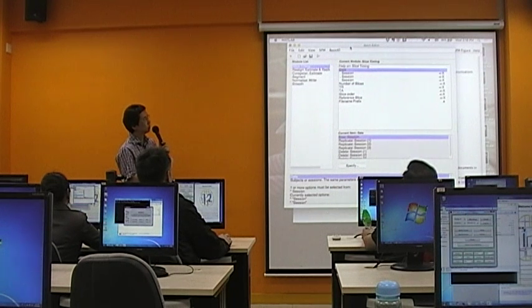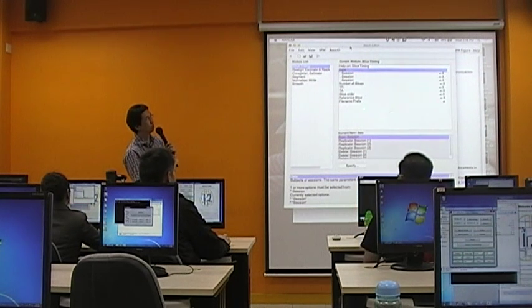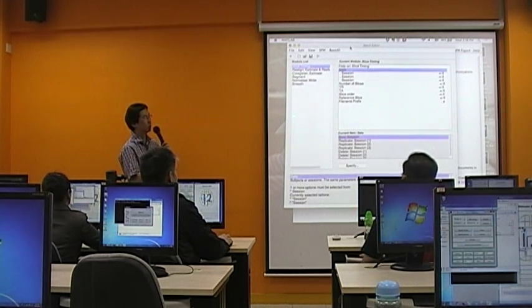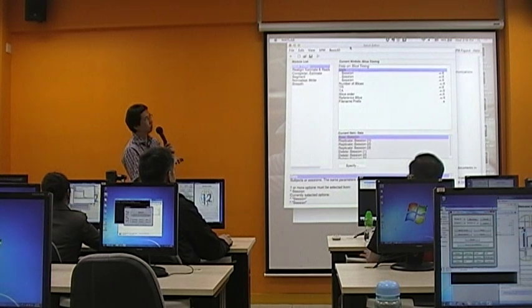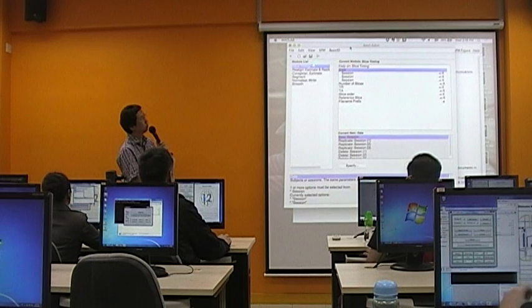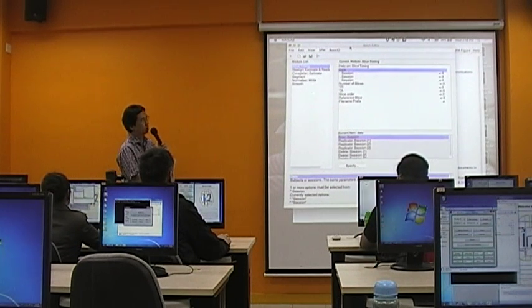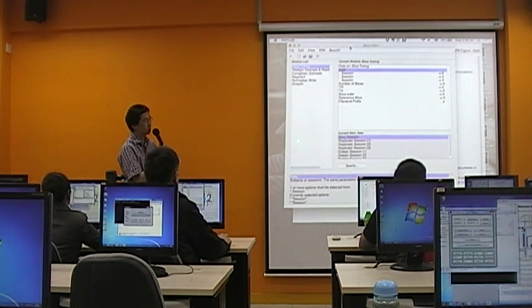And depending on the time, I might also make some slides, just some simple screen caps, so that you know what kind of information you need to put in for pre-processing. So anyway, on Monday we tried to build a batch that links all the files to one processing routine.